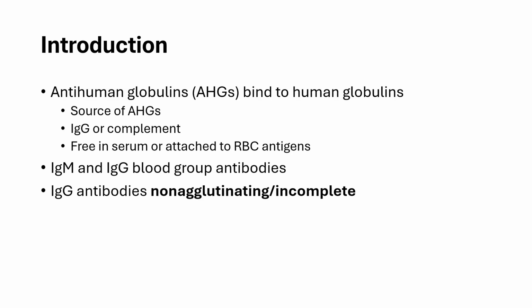The antiglobulin test. So anti-human globulins, or AHG, are reagents used in immunohematology to detect non-agglutinating antibodies or complement bound to red blood cells. They bind to human globulins such as IgG or complement components like C3 that are either free in the serum or attached to red blood cell antigens.